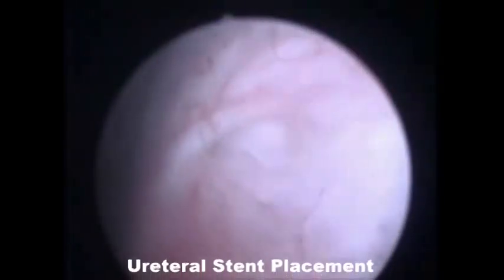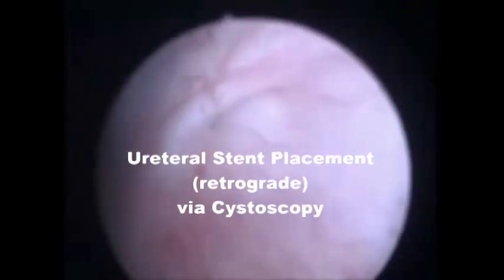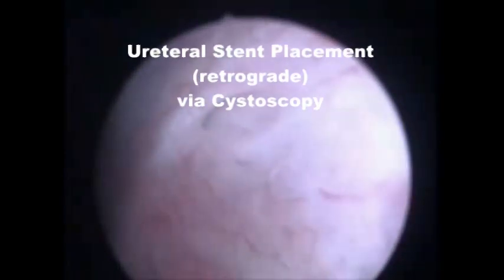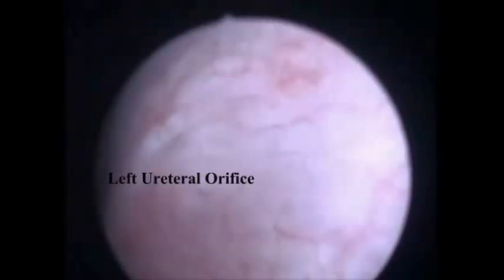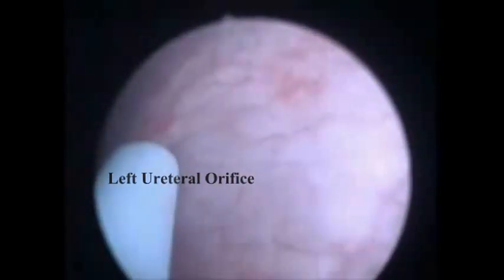A cystoscopy is performed by a urologist. In this brief video, we will see a urologist place two plastic stents: first through the left ureteral orifice, and next through the right ureteral orifice.